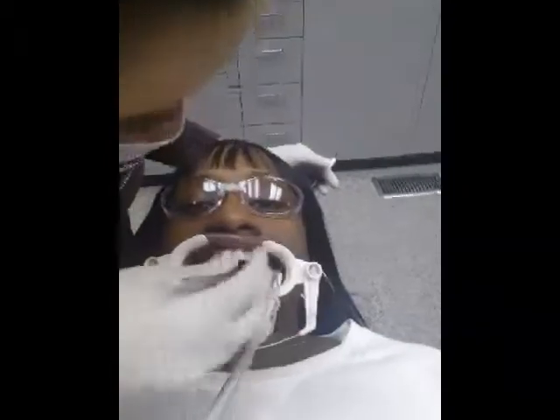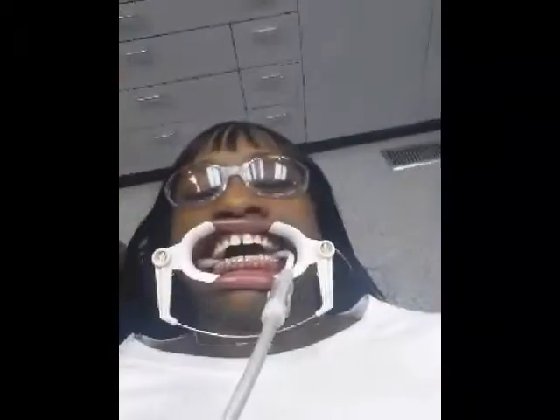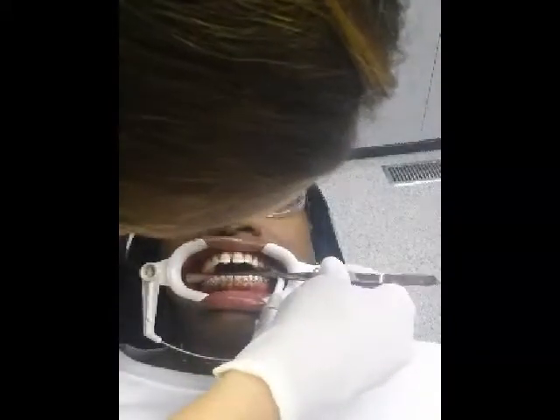Now after my teeth are all dry and she's put the primer on, she gets ready to place each bracket. And what I noticed that she did, I watched a few videos where they put the glue on the teeth and then they place each bracket on each tooth like that. But she, as I watched her, she put the glue on the back of the bracket before placing it on each tooth. And I think I like that she did that rather than just sticking the glue on the tooth and then sticking the bracket on there.